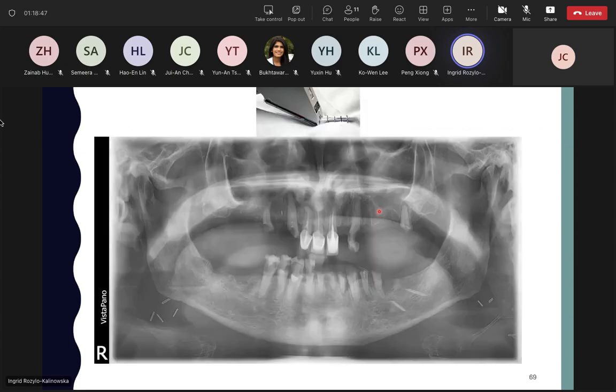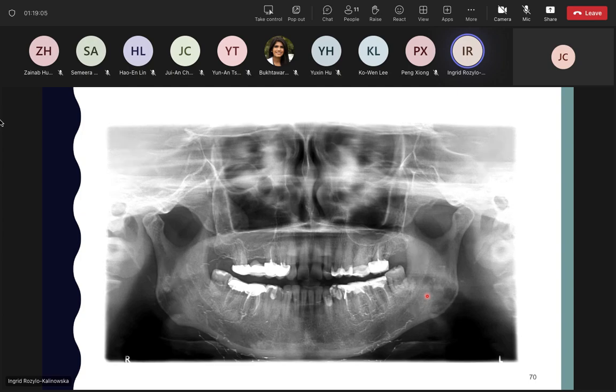And these are the so-called surgical clips. This is what's used by surgeons after surgeries instead of conventional stitching. So the real images and the ghost images of these surgical clips. This is a radiograph taken in the times when we still had conventional radiography and cassettes with intensifying screens.